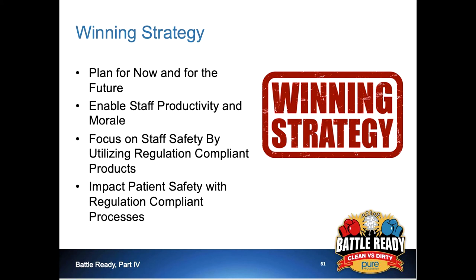The dirty zone is critical to clean and sterile when it comes to outcomes around people, around processes, and around productivity. When we don't do the planning and we aren't mindful of the importance of the red zone, we end up getting bottlenecks. More surgical volume is going to continue to grow on a more regular basis, and the devices have become so much more complex. What used to be 2 to 3 pieces in the past now breaks down to 6 pieces. We've just doubled your volume in what you have to process and get through your department with, of course, less resources. And unfortunately, departments are being asked to do more with less staff.